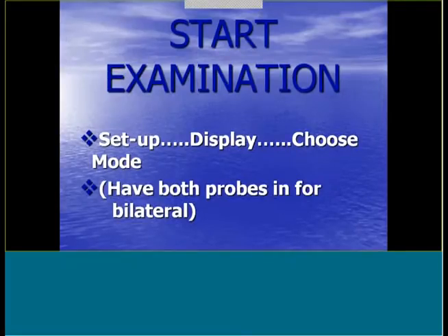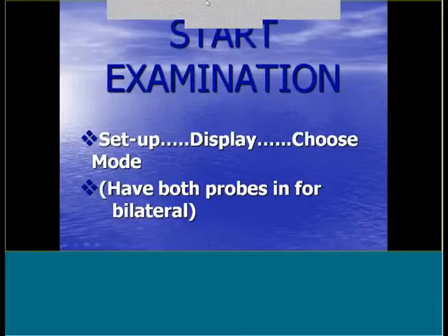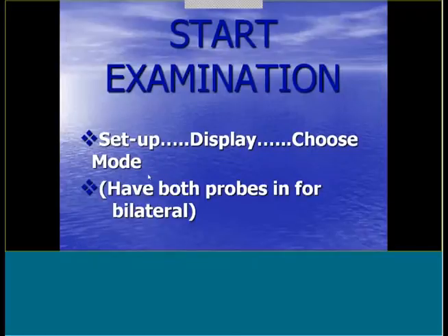Now, the next part, we go into the very next folder over that's setup. Now, we want to change the display. Let's say we do diagnostics. The display is showing a diagnostic procedure up there. It's got the vessel labels on one side, and it's got our spectral analysis on the other side. We want to change the display mode. We want to change it to monitoring. Remember, if you're going to do bilateral, you want to have both probes plugged in, or it won't let you go into bilateral. So in order to do bilateral, put both probes in.